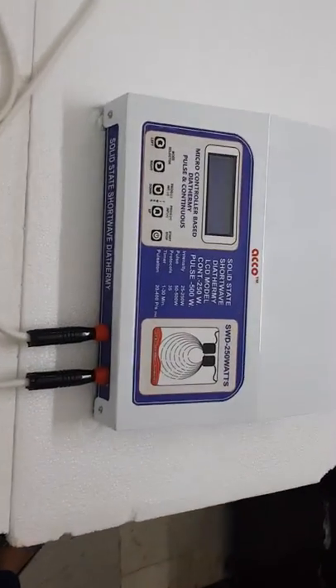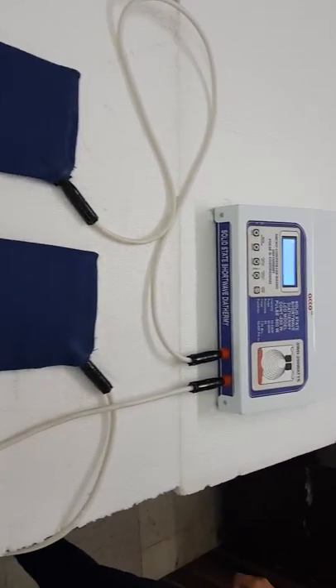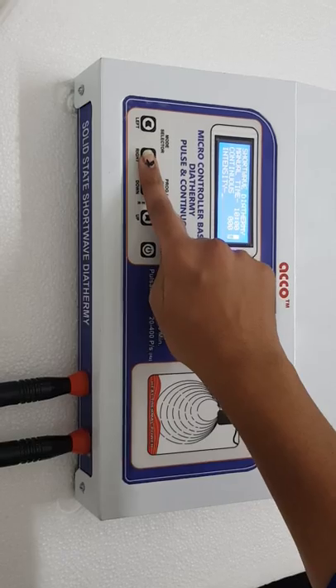Now we will show you the demo of Echo Solid State Shortwave Diathermy 250 Watt. Switch on the machine and select the manual mode. These are the selector switches to move the cursor.